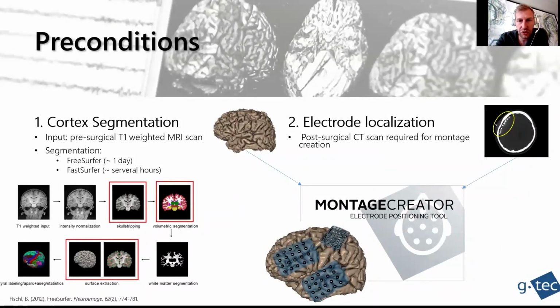Our usual pipeline is FreeSurfer or FastSurfer to get the cortical segmentation, the deep structure information, the ASEG, and the cortex parcellation also, so that we already have the anatomical landmarks. And of course, any other segmentation pipeline can be utilized, like SPM or 3D Slicer, but we usually use FreeSurfer for that purpose.